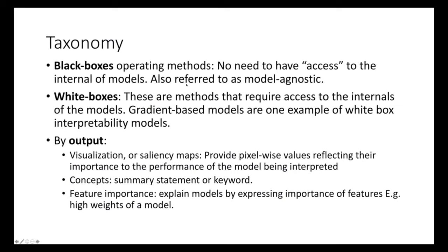Okay. All right, so let's try to open this black box. First we need to talk about some taxonomy. There are many methods that say they operate on a black box. What this means is that the method doing the interpretability does not have access to the internals of the model. They are also referred to as model agnostic. This can be the case when you receive a product from a company and you have no access to the internals of the system.